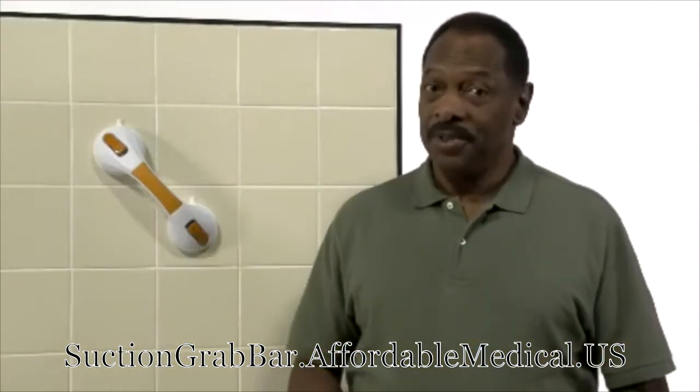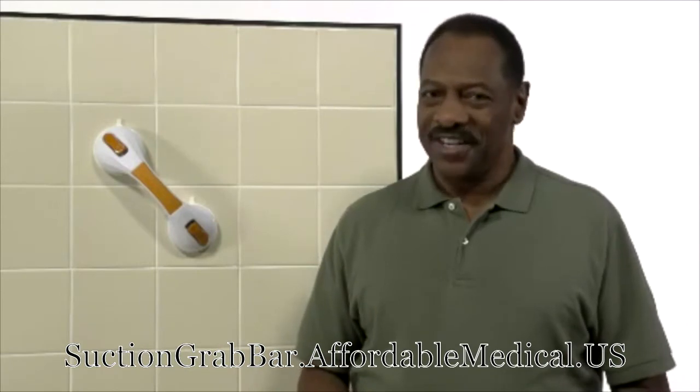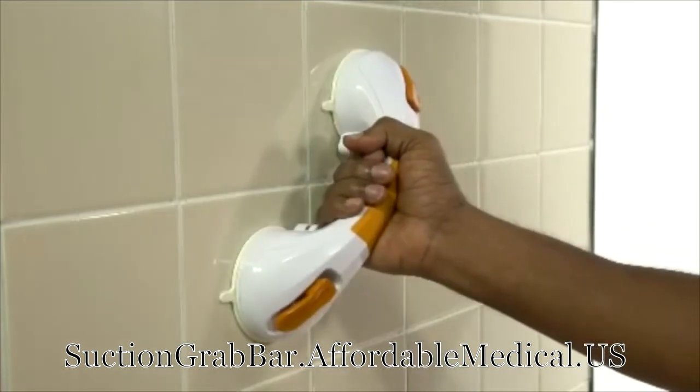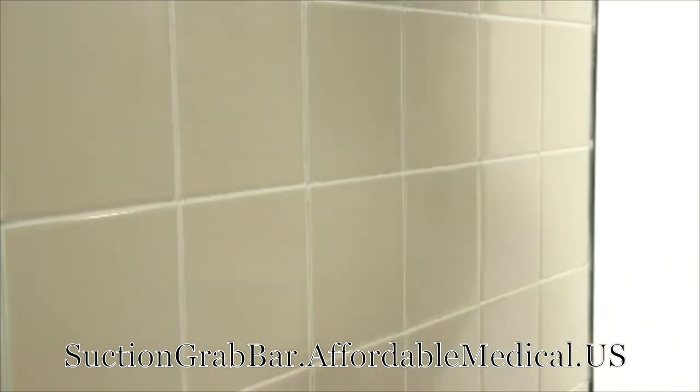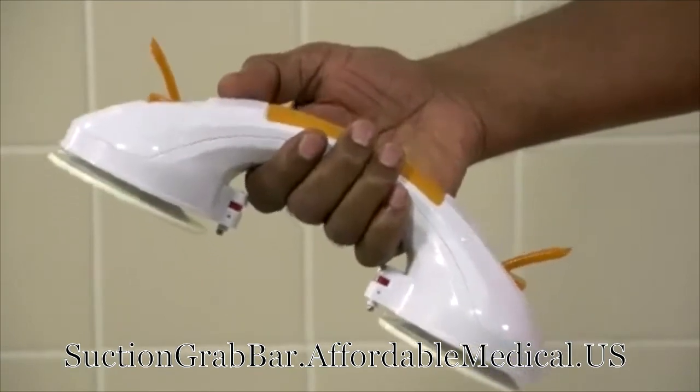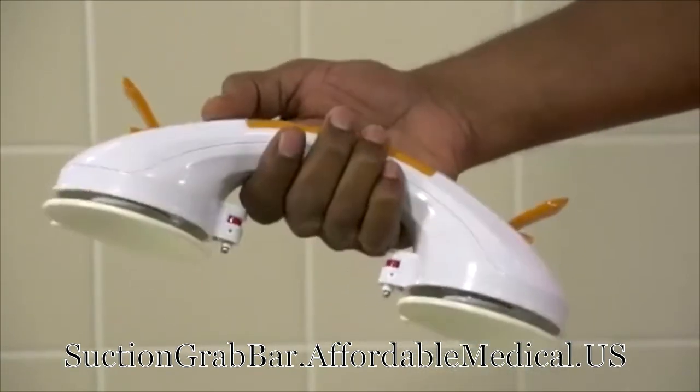Perfect for the bathroom, which is where the greatest number of household falls occur. The bar comes in a variety of sizes to fit your lifestyle. It attaches and removes easily in just seconds — drilling holes is not required for installation. In fact, you don't need any tools or adhesives.